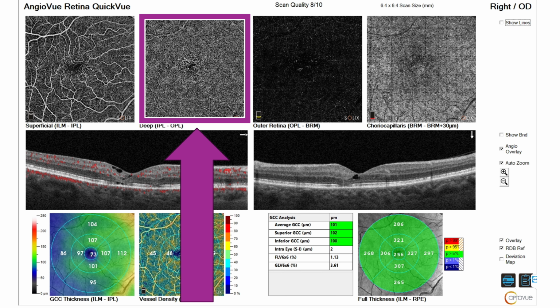Yes, that's a great point. Macular telangiectasia is actually a disease that originates in the deep plexus of the sensory retina. So it's somewhere in between the top and the bottom of the retinal scan. So when you're looking at OCTA, the area or the slab of interest, at least initially, is going to be that deep plexus. The deep plexus is somewhere around, let's say, OPL and towards the photoreceptors. But then it actually goes high to the superficial plexus and then goes back down towards the photoreceptors and beneath that. So it's interesting.